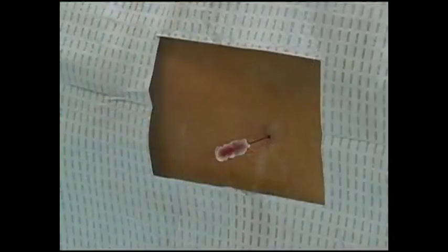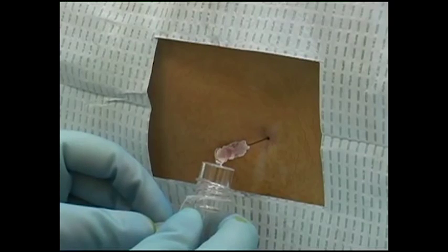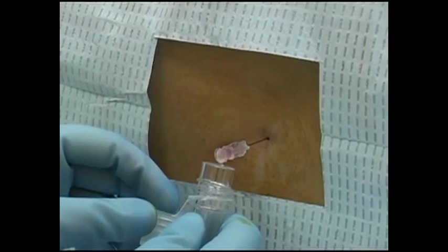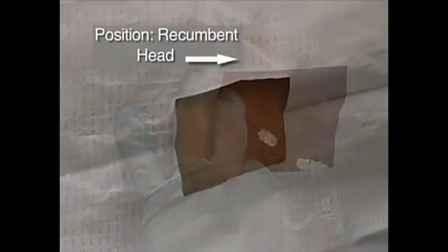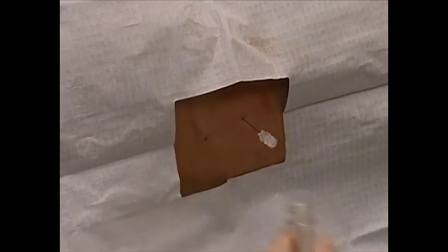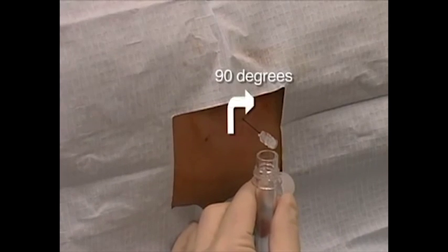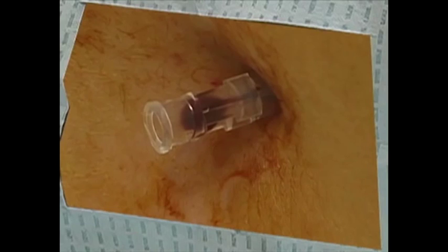If the lumbar puncture is traumatic, the cerebrospinal fluid may be tinged with blood. As additional fluid accumulates in the barrel, the fluid should become clear, unless the source of the blood is a subarachnoid hemorrhage. If the flow is poor, a nerve root may be obstructing the opening of the needle, and you should rotate the needle 90 degrees. If drops of blood enter the needle, it may become clogged. In this case, you should obtain a new needle and enter the site through a different interspace.